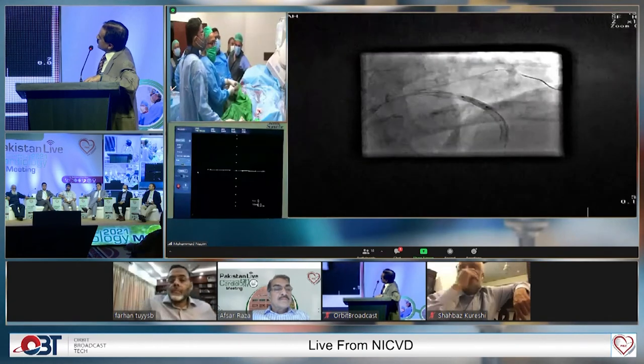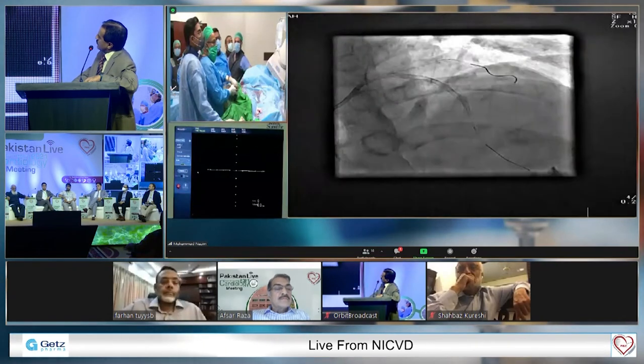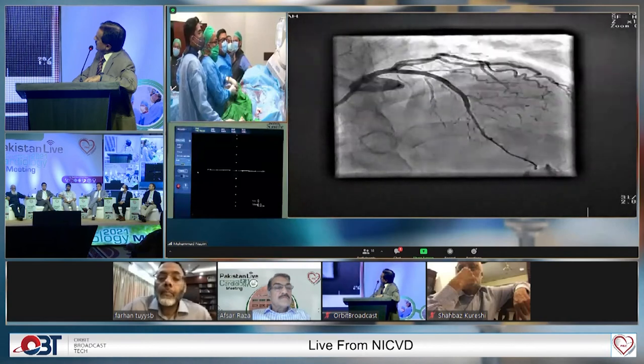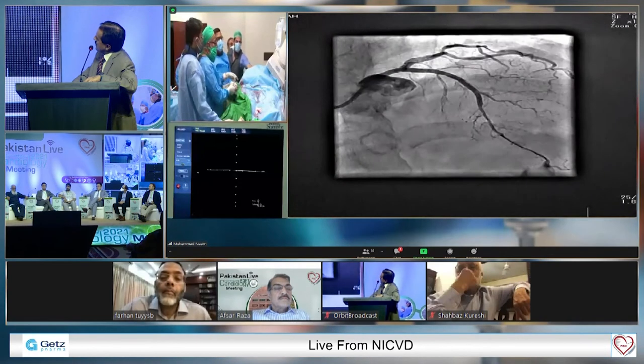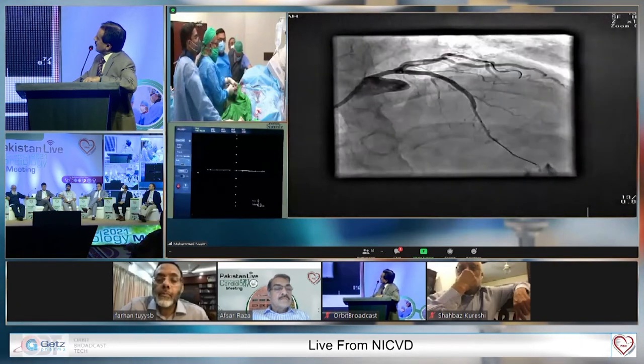Javed, just quickly show us the end result because we have to move on. The time is over. We have to move on to the cases. Now we are doing follow-up IVUS. And after that, we will take an NC balloon with guidance of that IVUS.